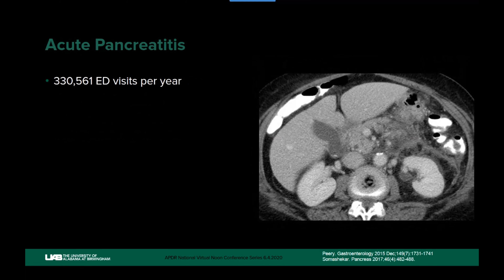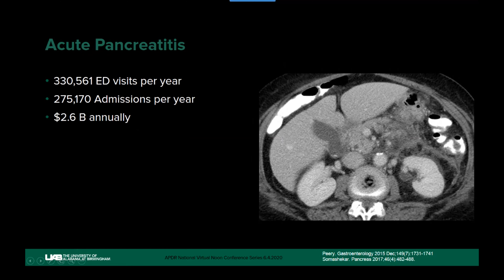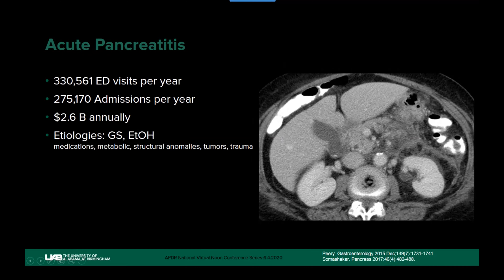Acute pancreatitis is a significant problem with over 330,000 ED visits per year. There's a 20% readmission rate, so you'll see these patients through all phases — not just at initial presentation, but through their drainages. The most common etiologies in our population are gallstones and ethanol use. We want imaging to detect and describe the pancreatitis effectively and also look for etiologies. In this example, inflammatory changes around the body and tail with lower enhancement suggesting necrosis can be seen alongside calcified gallstones — allowing both diagnosis and etiology identification.